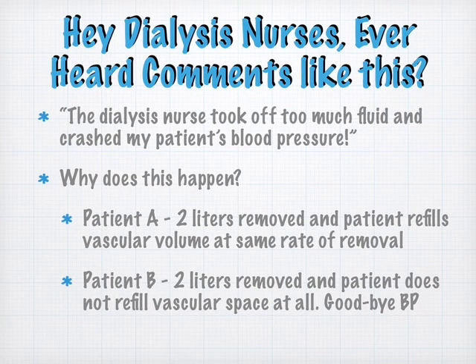So as a dialysis nurse, oftentimes if I was doing dialysis and their patient's blood pressure began to drop, I'd hear from nurses out in the hall that the dialysis nurse took off too much fluid and crashed my patient's blood pressure. Well, it's really hard to know what to do as the dialysis nurse in terms of removing fluid because we don't know, at least without a hematocrit monitoring, whether or not a patient is going to mobilize fluid. So this is what I mean.